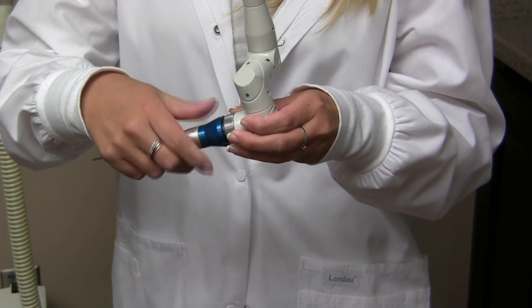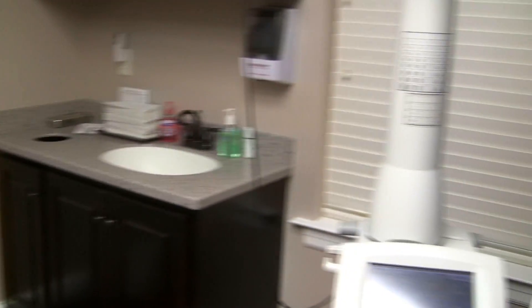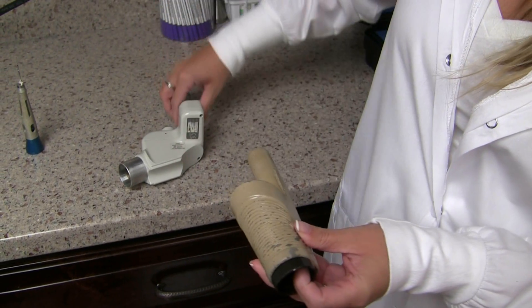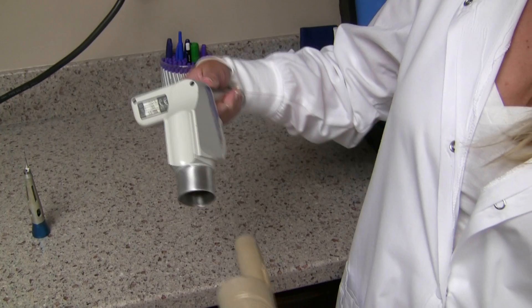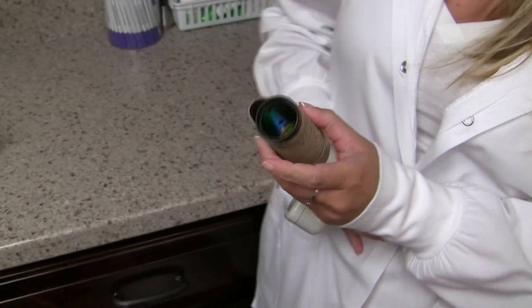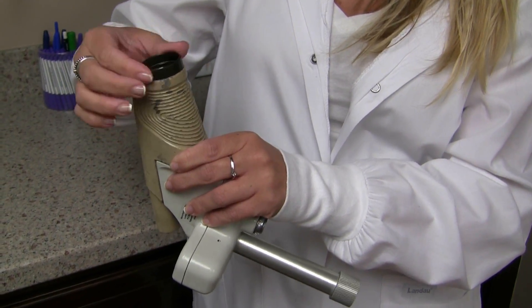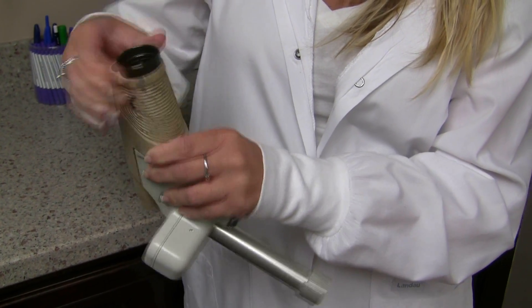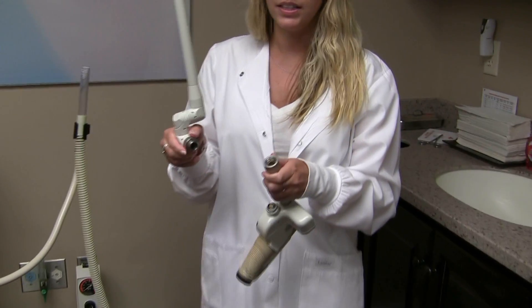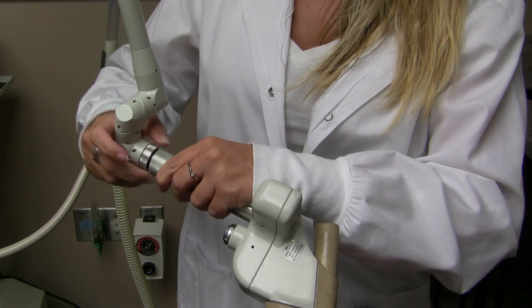Alyssa comes over to the cutting wand handpiece — she holds the silver and screws off from the blue, and that arm stays level. She then brings over the CPG handpiece: the black piece goes inside the tan piece. That laser handpiece never gets autoclaved or gassed — it just gets wiped off. The black piece screws on and holds the two pieces together onto the CPG handle.